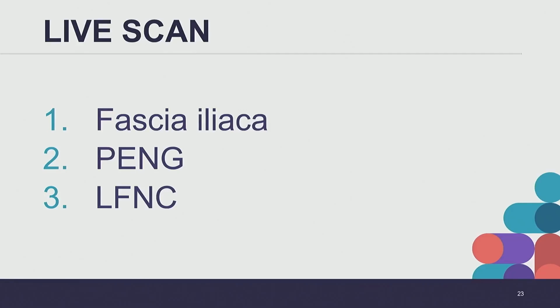Yeah, it's sagittal. Now, one tip to make the planes a little clearer: sometimes if you aim the cranial part of the transducer just toward the umbilicus ever so slightly, you do get a clearer view. But as long as you're really able to identify this AIIS, that pinch is right above that level. It does look a little bit better on my screen than it does on the big screen. So it may just depend on your ultrasound.